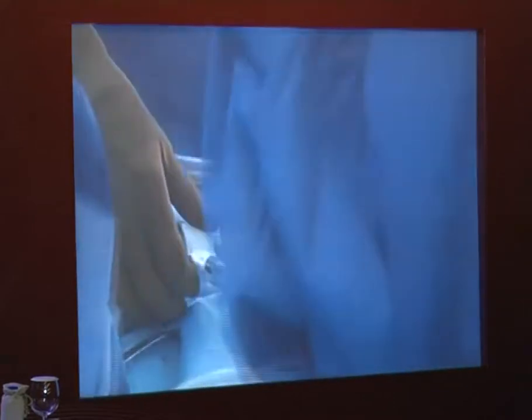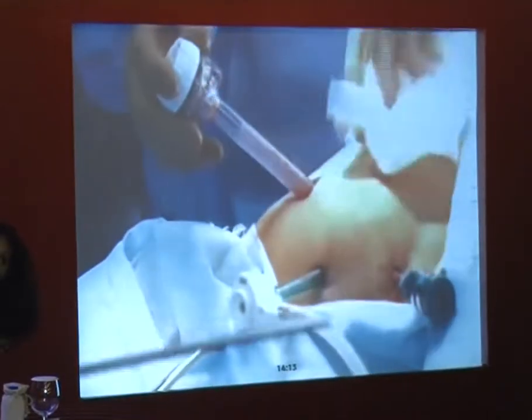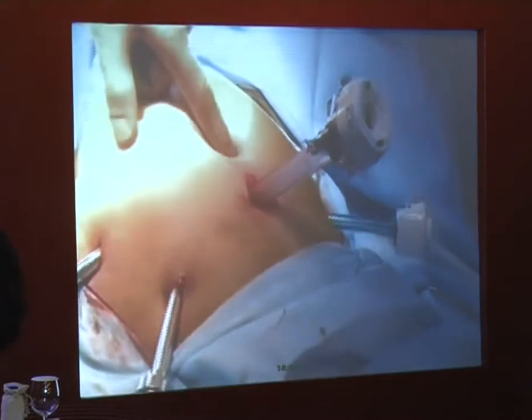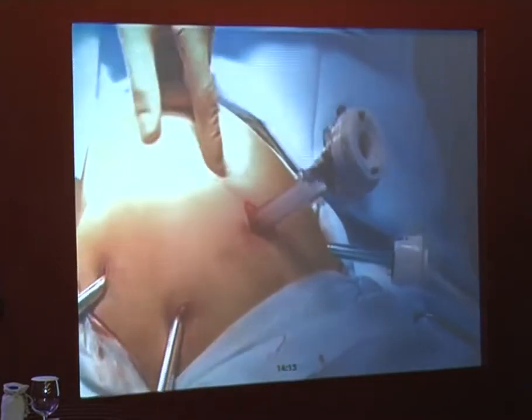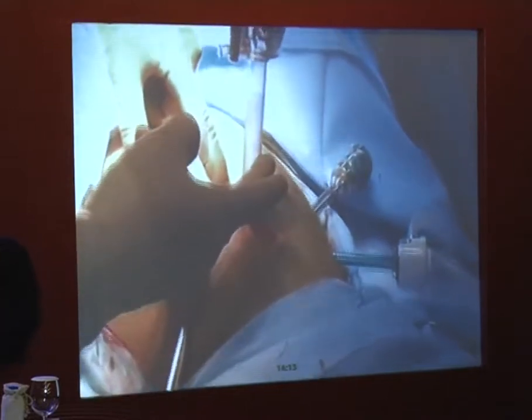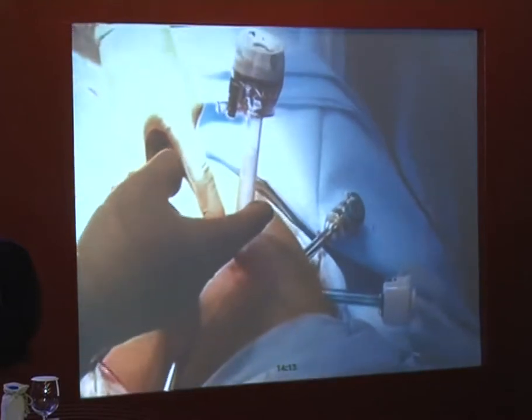Her symphysis is right about here. She had a prior C-section. Symphysis is here. So you see she's very petite because her xiphoid is right about here. So she doesn't have a lot of epigastrium. Her lateral ports are roughly in line with the level of the umbilicus. And then I've got an accessory. And then I've got what's going to be one of our operative arms. This will end up being arm 1, arm 2, arm 3.